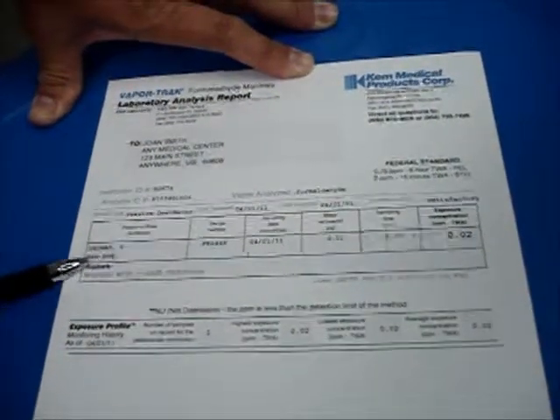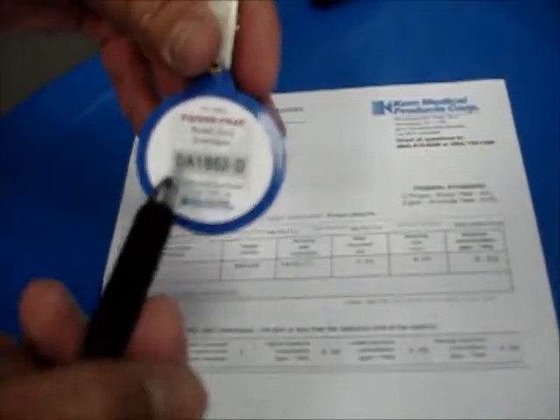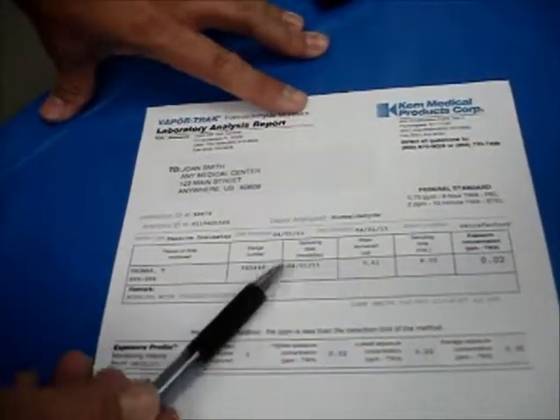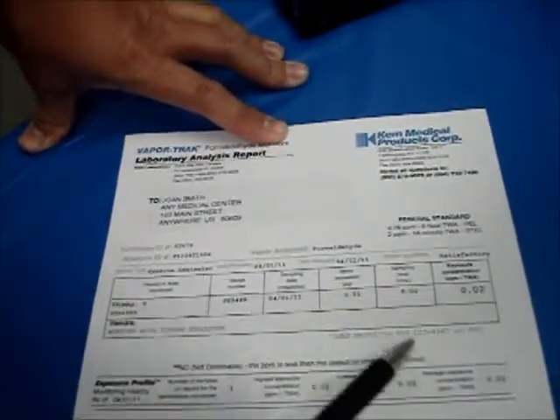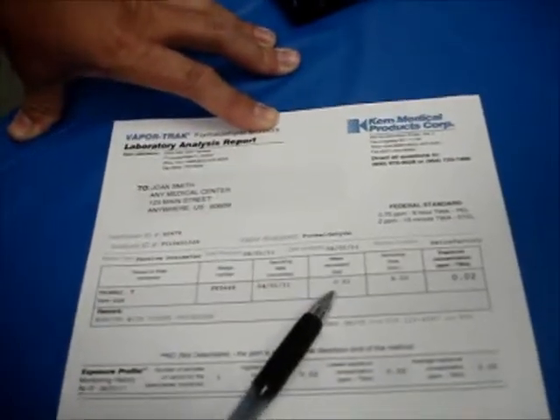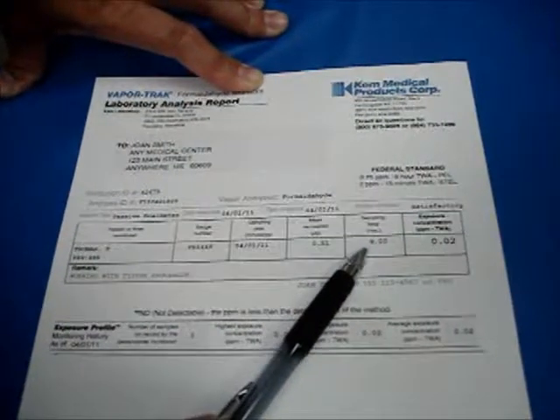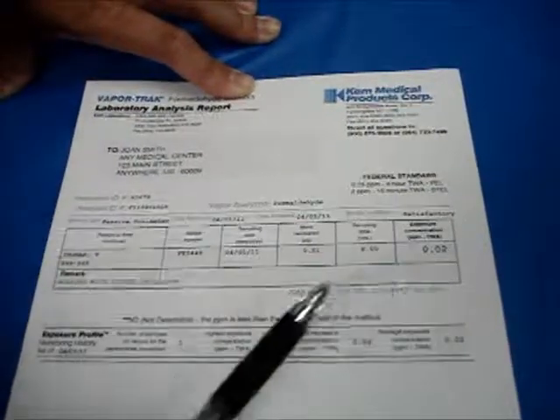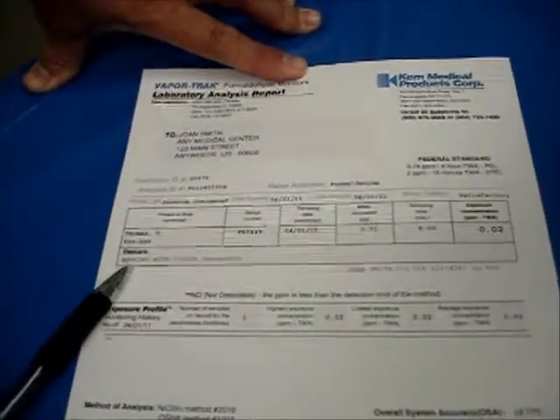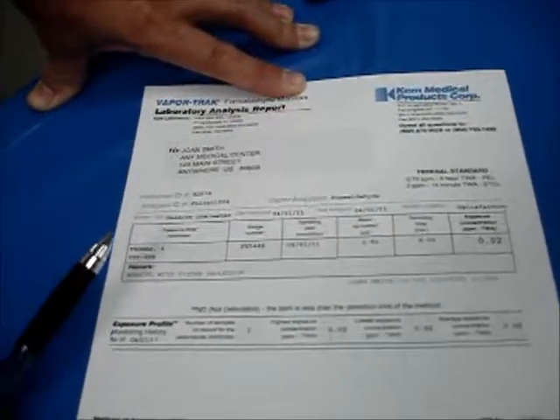Here's the person — T. Thomas — and the badge serial number. On the back of every monitoring badge there is a serial number. So the report shows the serial number of the badge used, the date the badge was used, and the mass recovered — that's more for the laboratory, the actual amount recovered onto the badge. The sampling time is the duration the badge was used — this particular badge was used for eight hours. Then the concentration: 0.02 ppm for this particular badge. The remarks correspond to whatever you wrote on the outside of the mailer box — working with tissue processor, near the sterilizer, whatever the case may be.